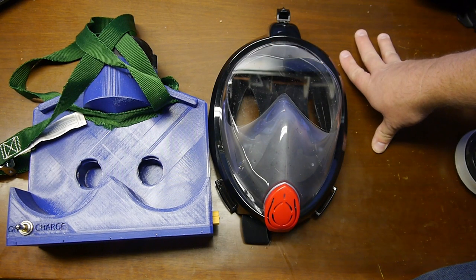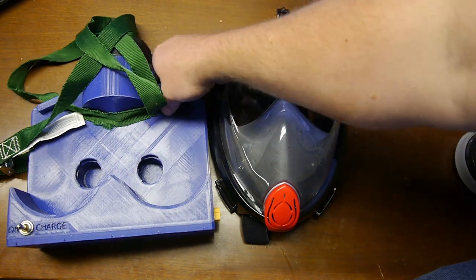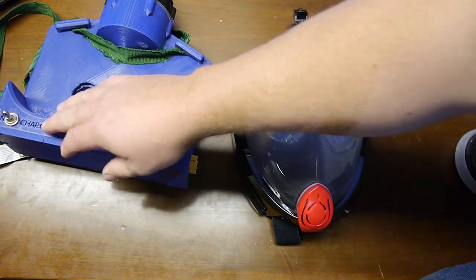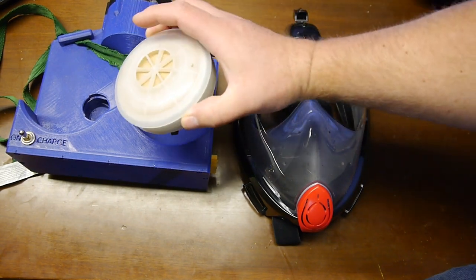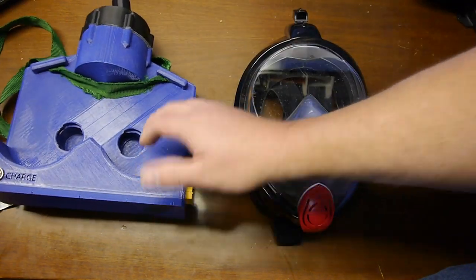The world has fallen on dark days due to the beer bug, and things are looking grim. There's hope, lots of hope, but we're in a tight spot. So you recognize this maybe from my previous video. It's a PAPR, personal air powered respirator. It uses a CPAP, Arduino, some batteries. What would typically go into like a gas mask on the side, go in here. And I've been using it in my shop, woodworking shop.